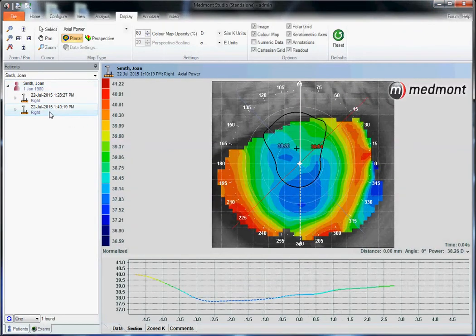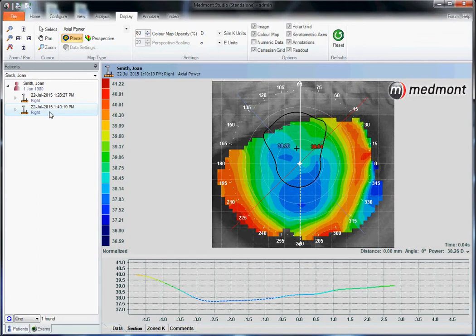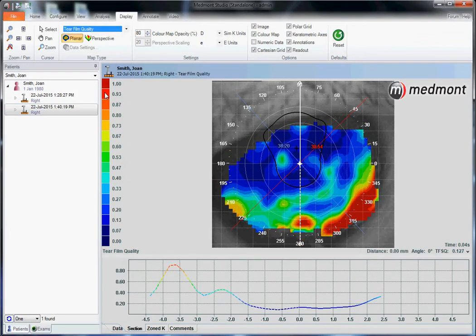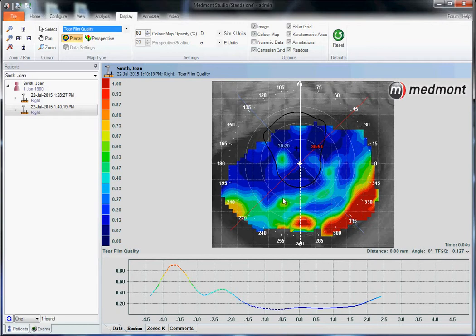And here's our tear film video. What we'll do is go to display and change from axial power to tear film quality. And this now uses the Medmont TFSQ or tear film surface quality assessment to determine the degree of this patient's dry eye.